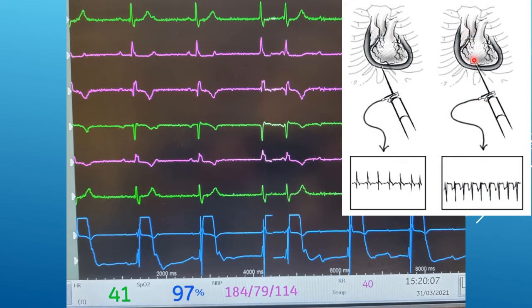Should you touch the heart and see ST elevation, you know that you've passed through the pericardium to get there. Simply withdraw slowly until the ST elevation resolves. If you can aspirate fluid at that point, you're in the pericardium.